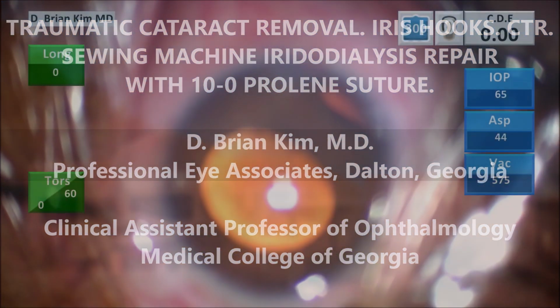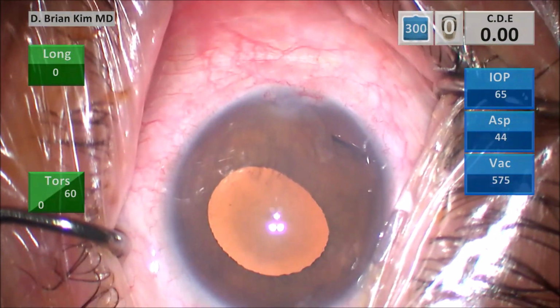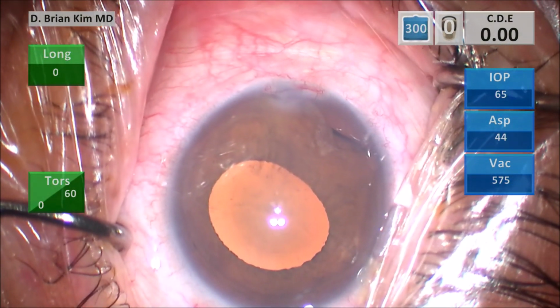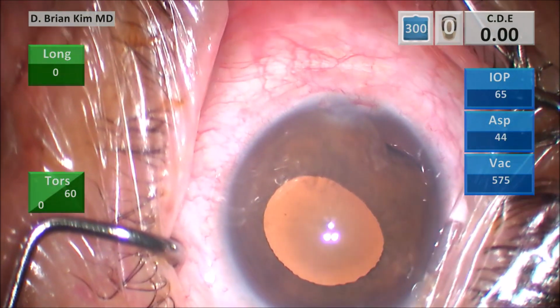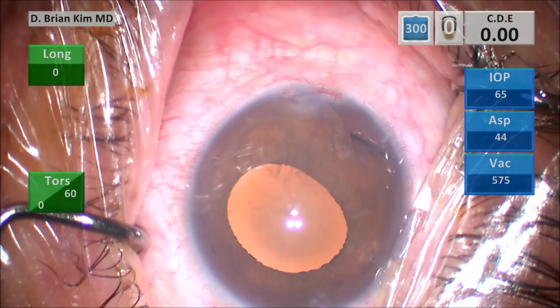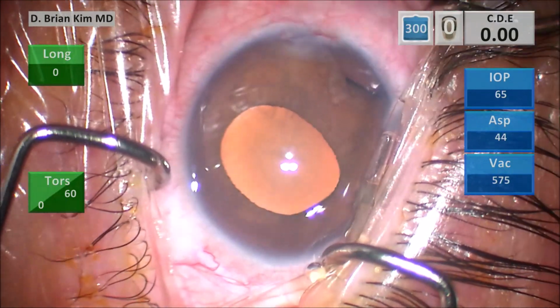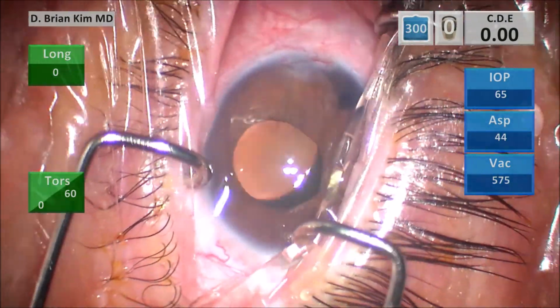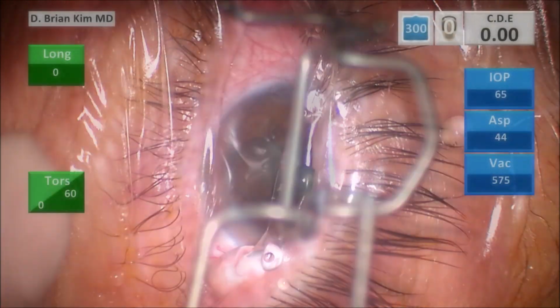So you can see this is the eye. You can see the dark haze of the traumatic cataract. You can see the iridodialysis. And this is a standard Lieberman. I'm noticing the opening superiorly and inferiorly is rather limited, so I'm putting in this modified asymmetric narrow wired speculum. The narrow wire is superior. This is a speculum that Epsilon has developed for me, and I've been testing it out.